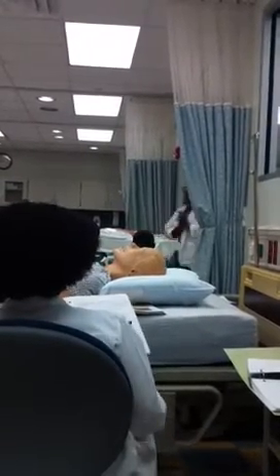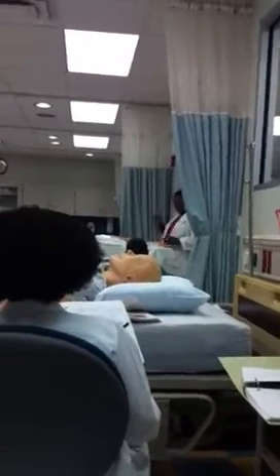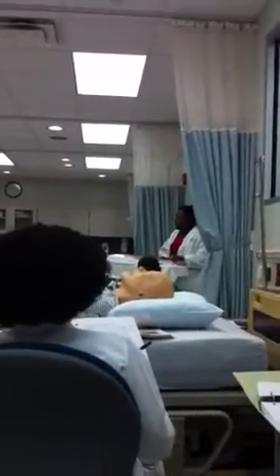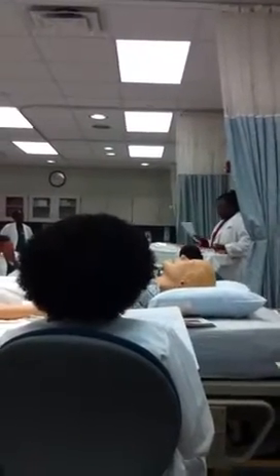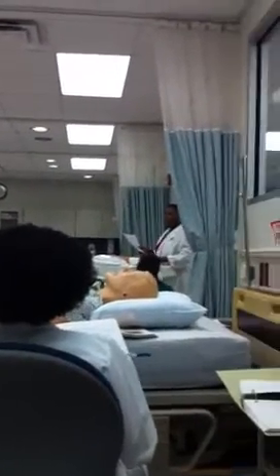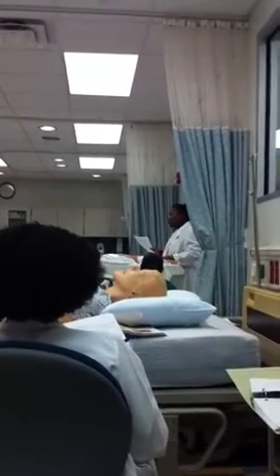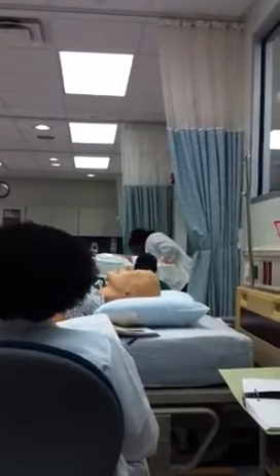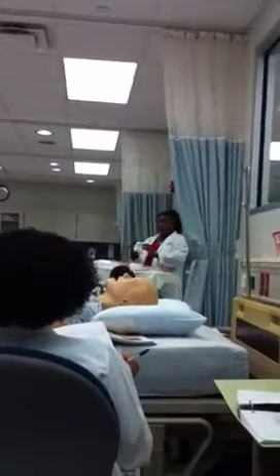Put my stuff down. Wash my hands. Alright, come back. Alright, Miss Smith. Knock, knock. I'm back. May I please check your bracelet? Can you please tell me your name? Smith. My medication record says Smith. She says Smith. Right? Identify my patient. Check my patient. Have my supplies. Put on my gloves.